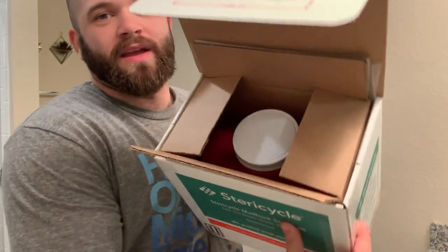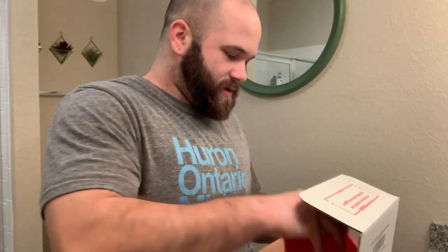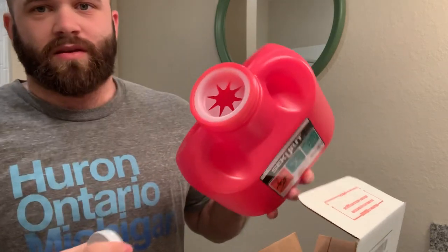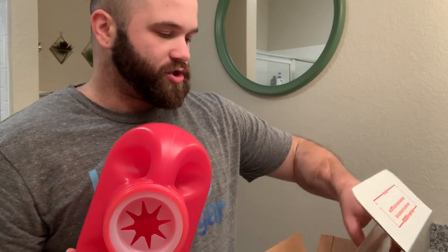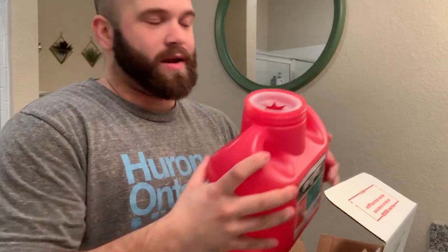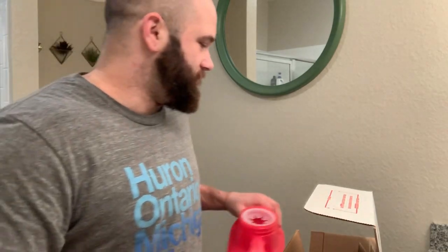So you open it up and inside is the actual container. You just take off the lid and the sharps go in there. When you're done, it gives you a sharps bag that you put the container inside of. Then you put it in there, and it already has the return postage on top — so you don't have to pay to send back the collection. Pretty good deal. Free — can't beat that.